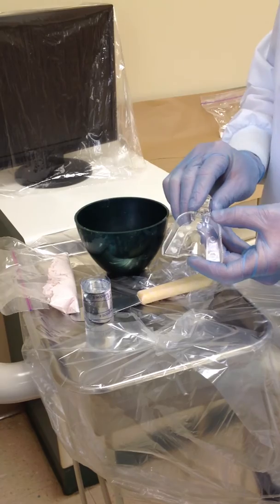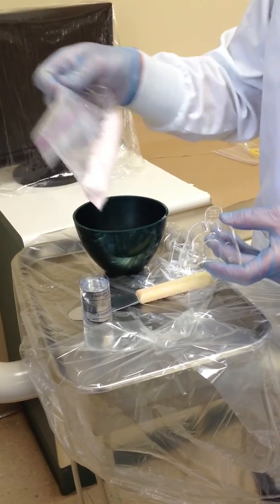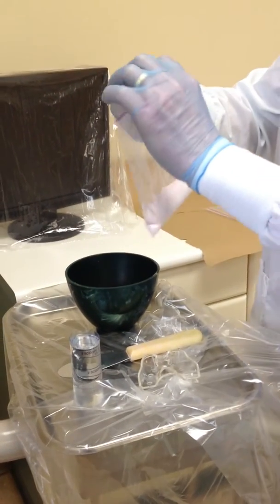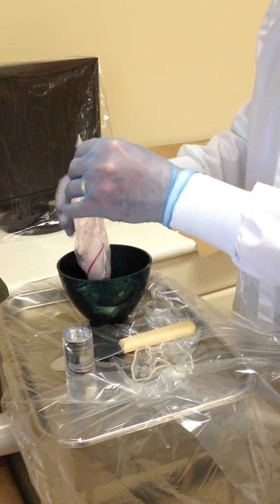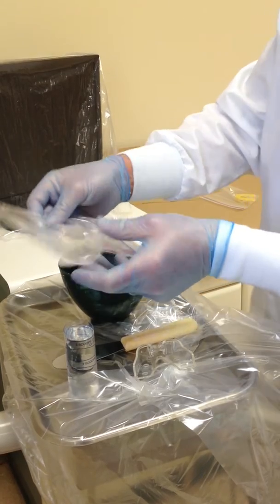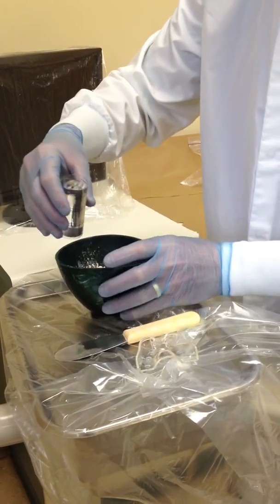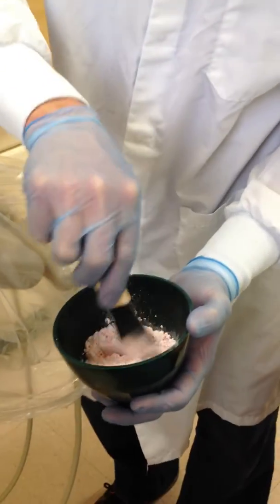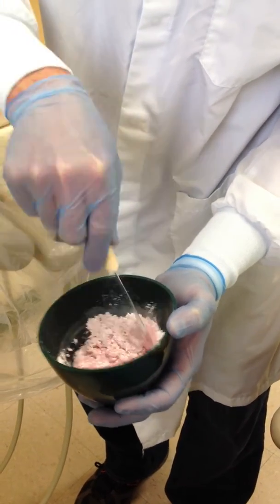We have water in our cylinder for three scoops of powder, which we have measured out, our spatula and our mixing bowl. As you have seen in previous videos, we will add our powder to the bowl, add our liquid to the bowl, and begin to mix slowly so we incorporate the powder and keep it off of our patient.